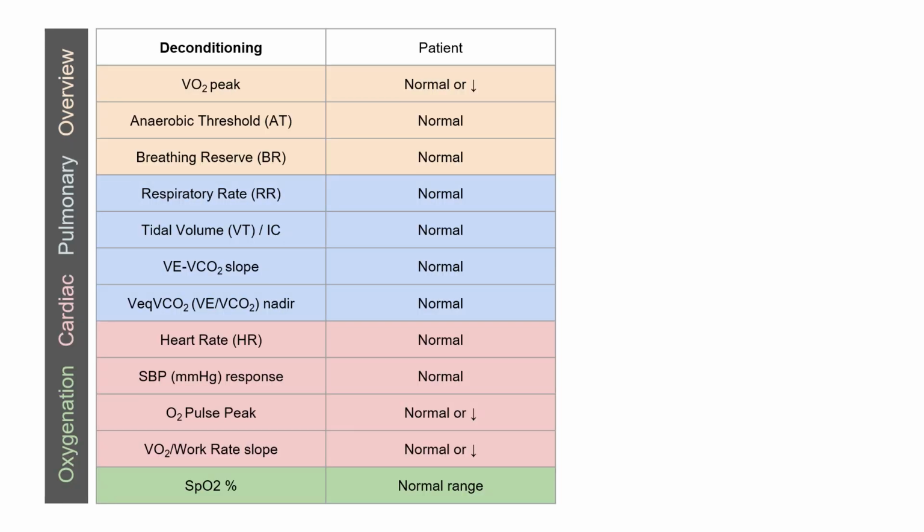Remembering the adaptations that our bodies make during exercise and endurance training, think of deconditioning as the opposite. In deconditioning, it is almost like a mild disease form. You can have a reduced stroke volume, and thus you have to rely on your heart rate climbing very quickly to compensate during exercise, similar to a cardiac myopathy. You also have impaired peripheral muscular contraction and O2 extraction because your mitochondrial function and density is reduced, and this leads to early fatigue and poor O2 delivery.